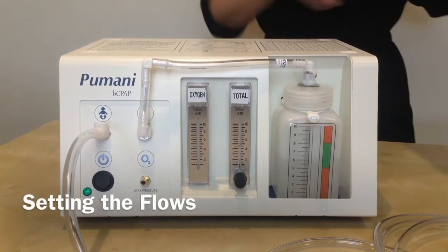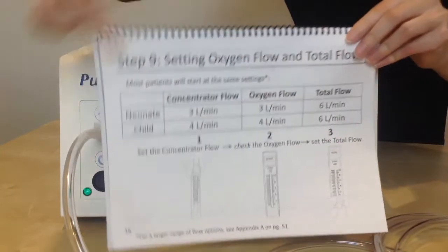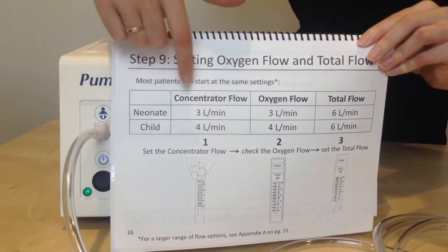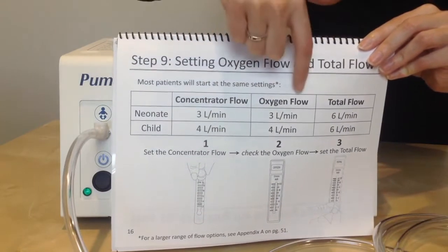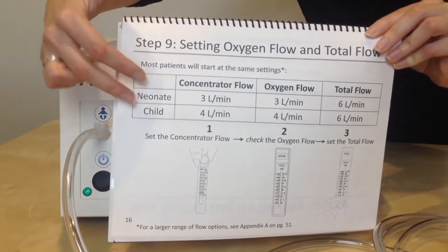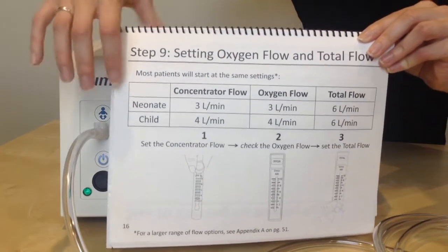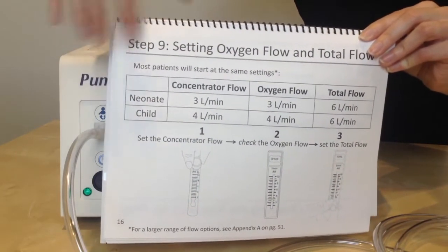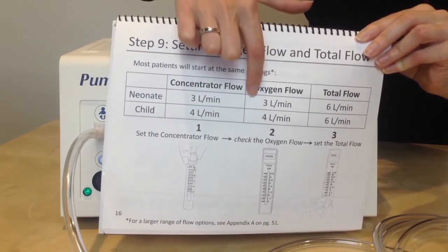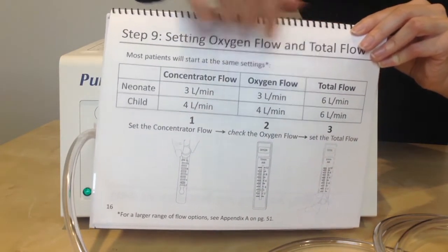To set the total flow and the oxygen flow, you will want to look at page 16 of the manual. This shows the concentrator flow, which is the same as the oxygen flow, and the total flow for two different patients. These are typical settings for these patients, but you can always adjust them. For our neonatal patient, we're going to set the concentrator to 3 liters per minute, confirm that the oxygen flow is 3 liters per minute, and then set the total flow to 6 liters per minute.